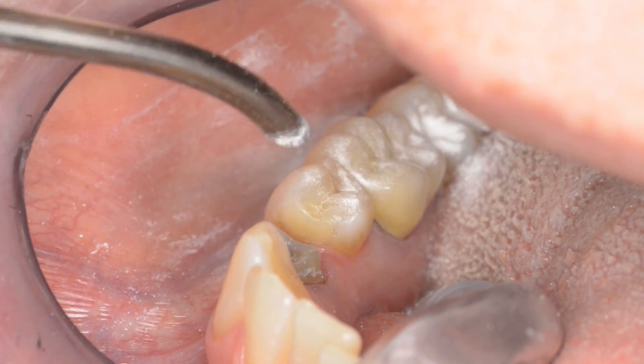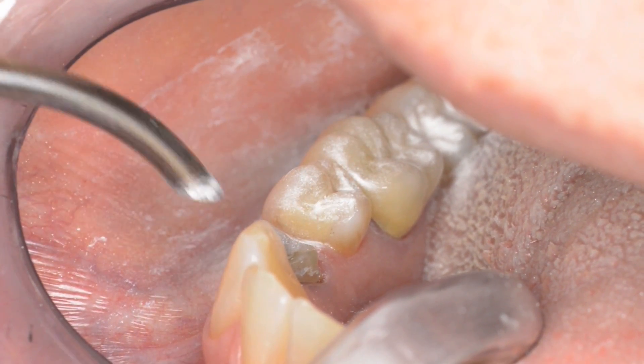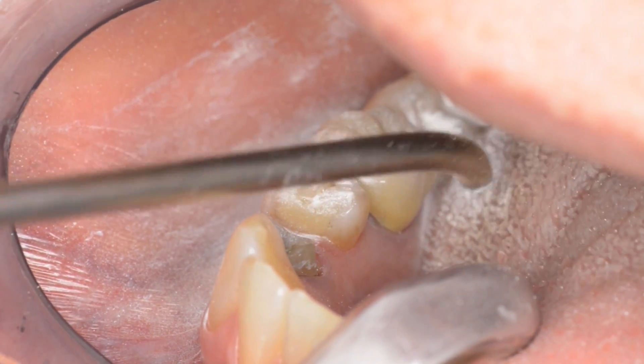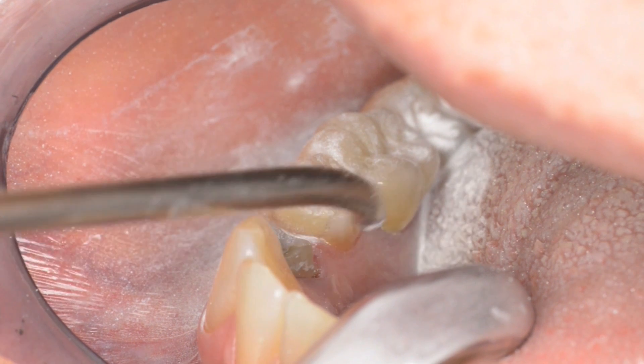As you can see, the nozzle is missing the lingual surfaces here. Also in this case, the tongue is not isolated sufficiently and therefore powder is being removed from the lingual surfaces. Always turn the nozzle and not the powdering device.